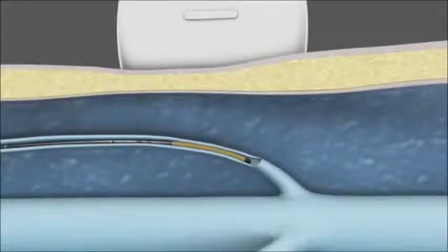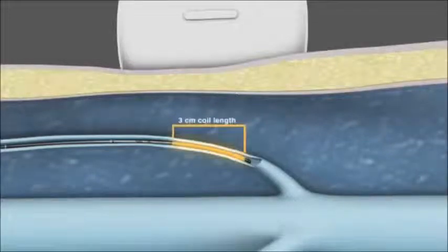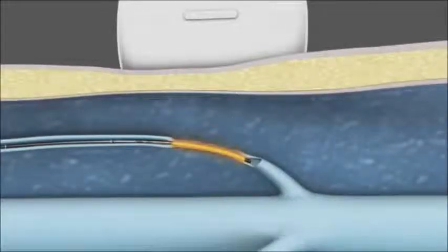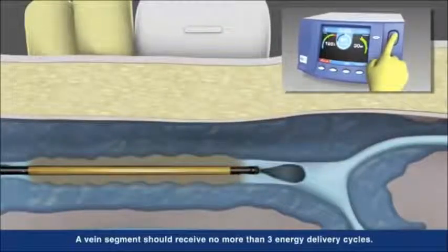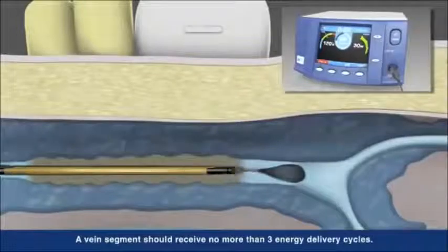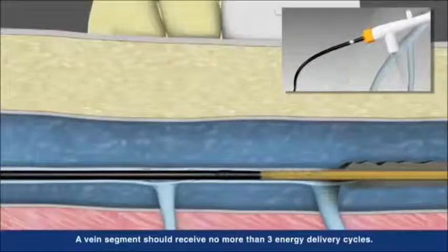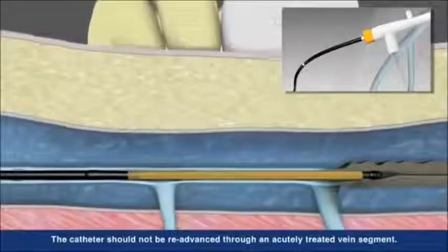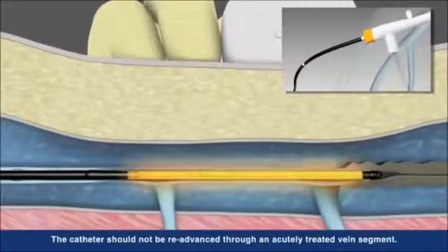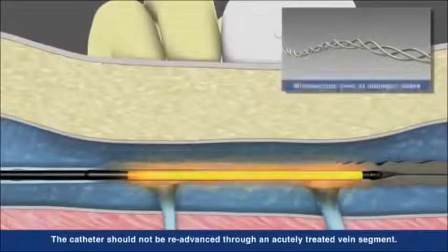Working together with the closure RFG generator, the catheter is designed to deliver controlled consistent heat to each segment. After each segment is treated, unique shaft markings on the catheter aid proper repositioning to the next segment. The heat provided by the catheter shrinks and denatures the collagen and smooth muscle.